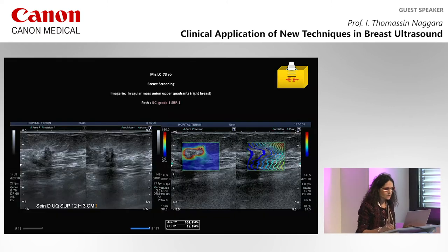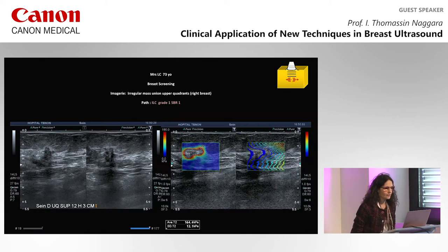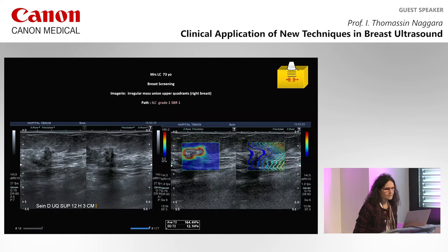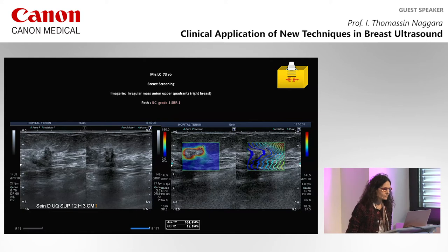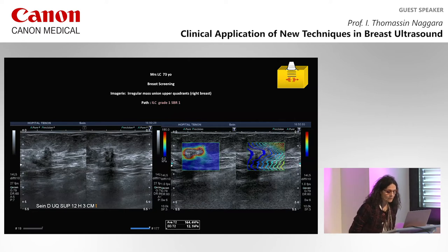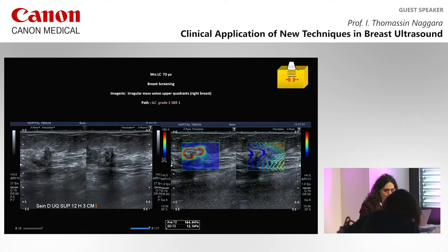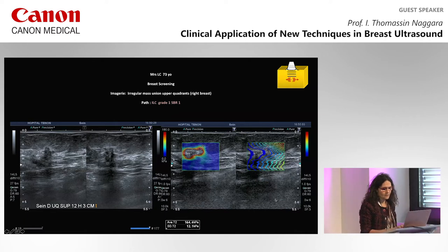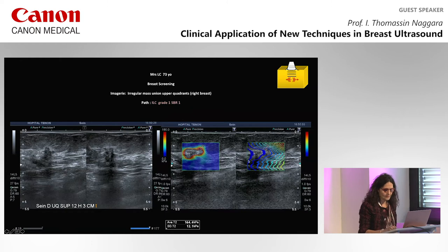Here is an example: a 73-year-old woman referred for breast screening with an irregular mass at the union of the upper quadrants on the right breast. This lesion was an invasive lobular carcinoma, and you can see that the stiffness value is very high — 164 kPa in this example — with all signs of malignancy visible on elastography.